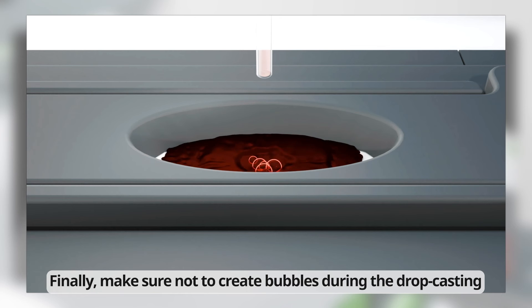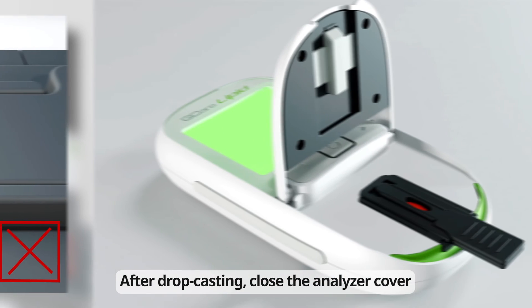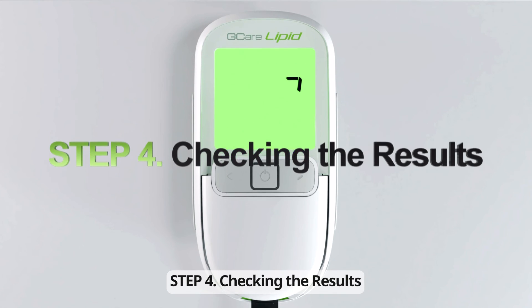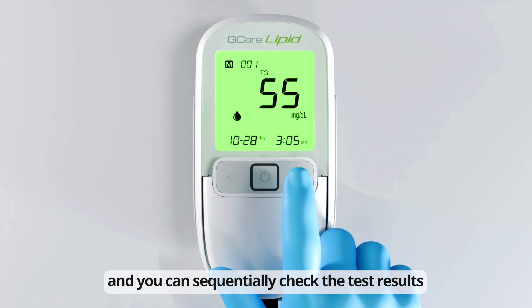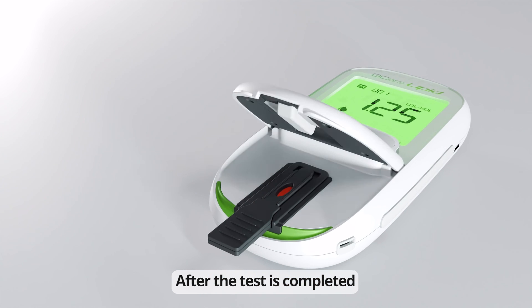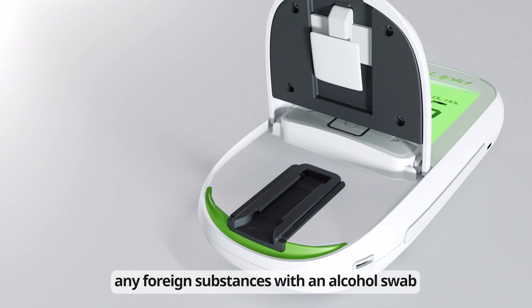Finally, make sure not to create bubbles during the drop casting. After drop casting, close the analyzer cover and wait 150 seconds for the test results. Step 4: Checking the Results. The test results are displayed on the screen and you can sequentially check the test results of each item by pressing the button. After the test is completed, remove the test strip and wipe off any foreign substances with an alcohol swab.